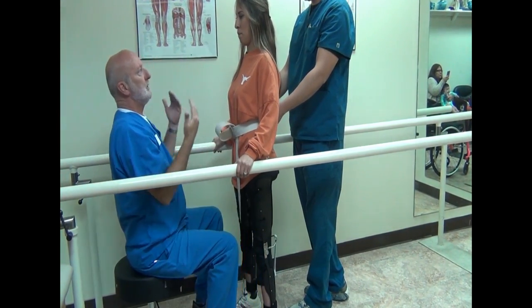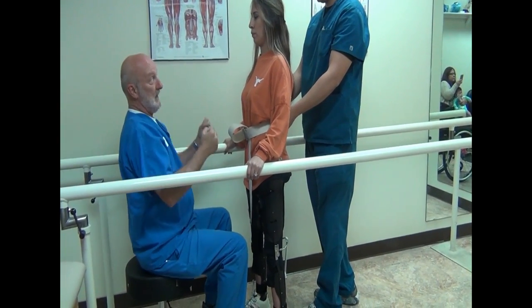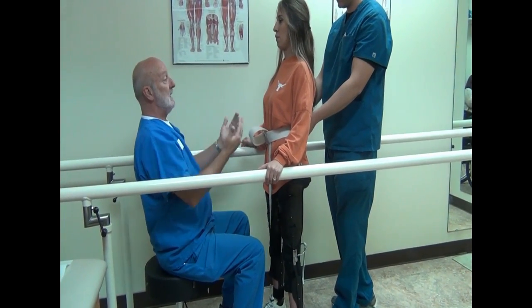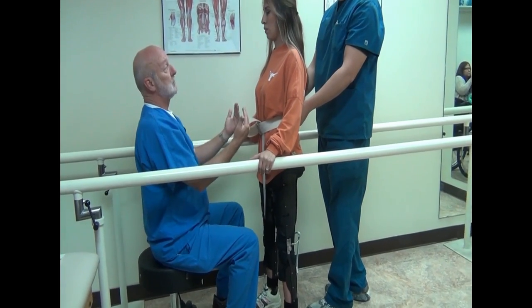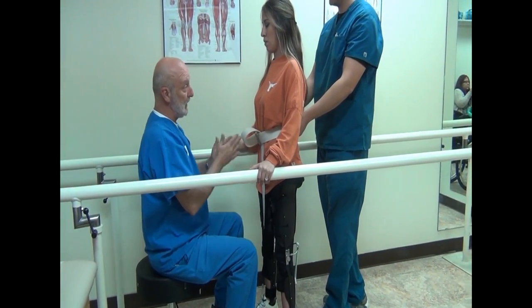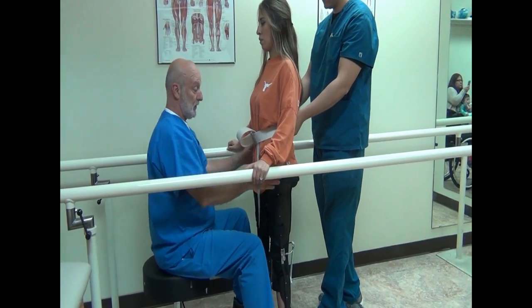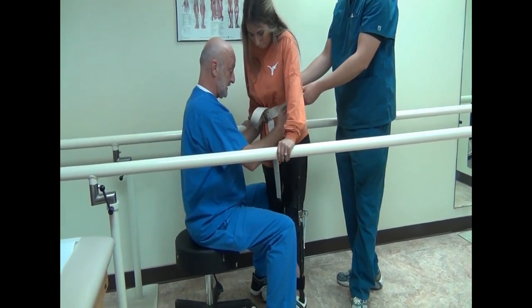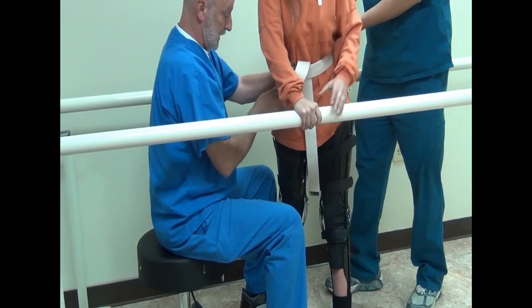If you're bent forward, then you're using trunk muscles and trying to fight to keep yourself erect. Whereas if you can get your body centered over your legs and not get your legs too far out in front of you, but keep your weight centered over each leg for each step you take, it'll be much easier. So we're going to turn around — shift your weight over to this leg, now bring this leg forward a little bit.